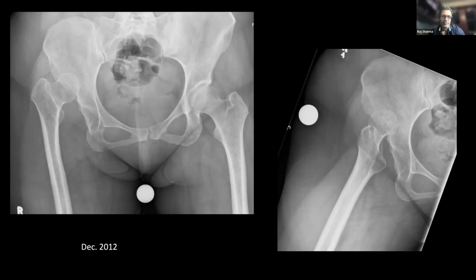Advanced things beyond that. These are really tough cases. These are all nice theoretical things to say, but actually getting that proximal femur down to the native acetabulum is a struggle. So soft tissue releases might be necessary. Some of the abductors, you may need to do some partial releases. These are all technical things, psoas tendon, adductors, all these things play into consideration of soft tissue tensioning in order to get that proximal femur back down. And that's what I would do in ceramic on poly. Make sure you have small cups available as well. Yep, sure. Okay, Steve?